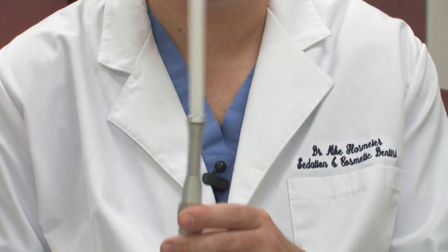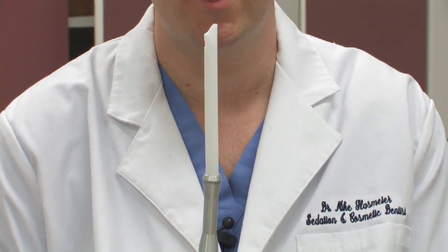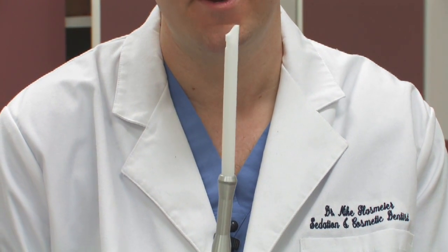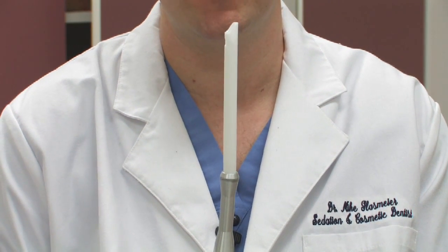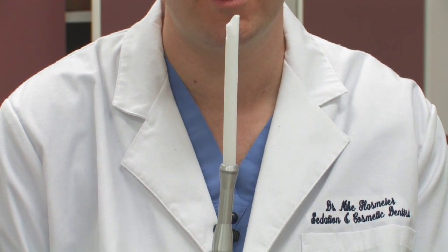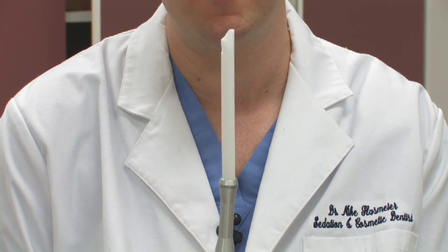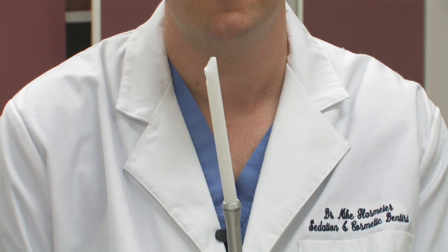The last one is called the high volume evacuator, most commonly used during fillings. If a dentist is preparing a cavity or removing an old filling, this one generates a lot more suction and is also a lot louder. It is responsible for assisting in keeping the field clear, and most importantly, it prevents any larger objects from going into the back of the mouth.